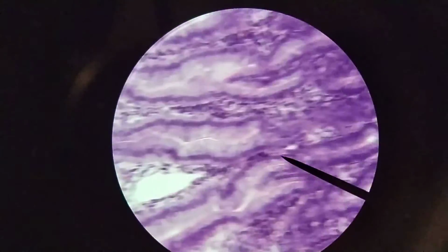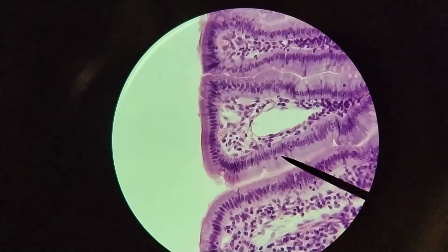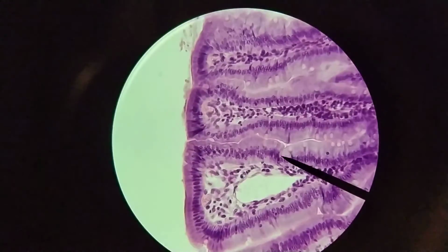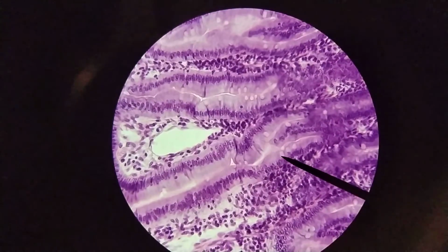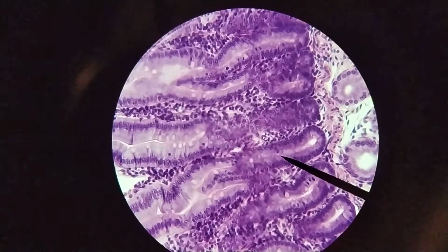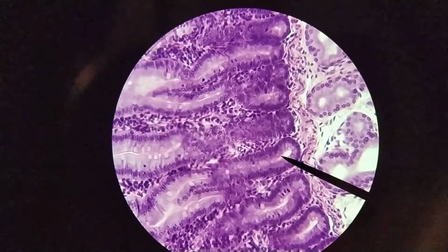Now we can see out here, this is the epithelium that covers a villus. So here, going across and down here, that's a villus. Okay? Now, when we go down here, you'll notice that it kind of splits off. The space between the villi splits off, and we get this kind of a gland here, or in this case it's called a crypt. It's called the crypt of Lieberkühn.